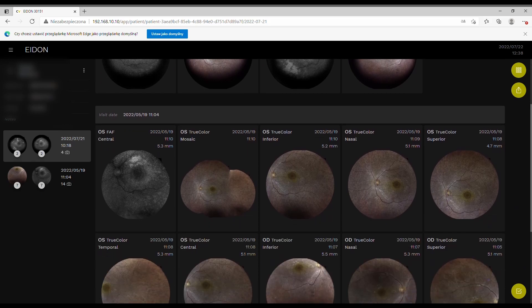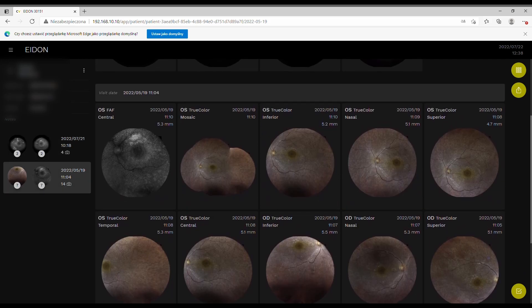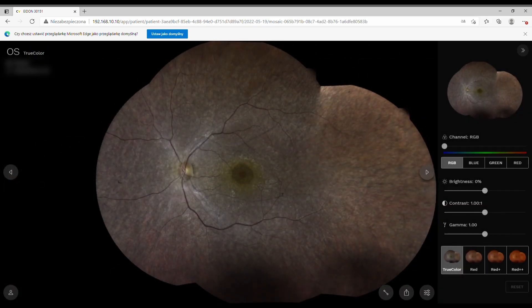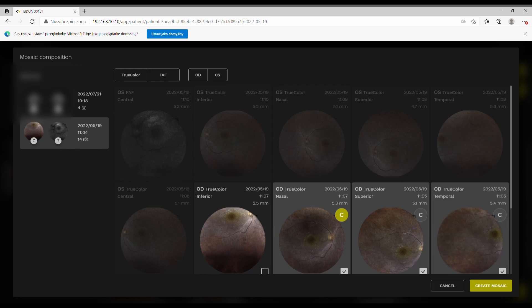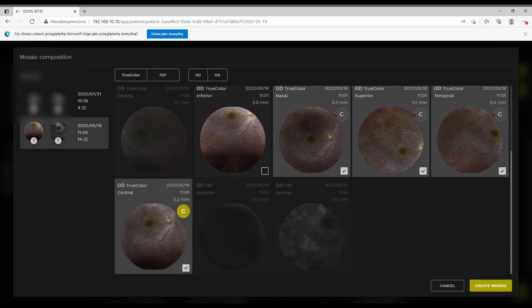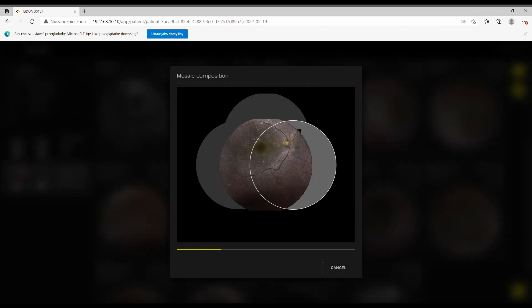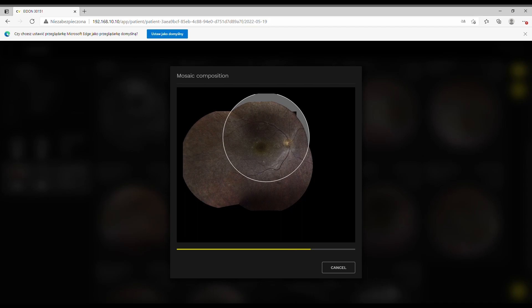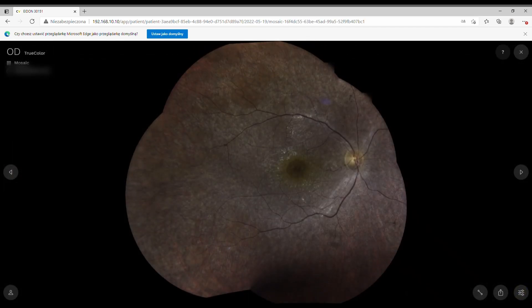If you click on a patient, all images taken are displayed. For mosaics, you can either select the image type before taking shots or create one afterward — once done it stays in the system. You can apply all the same filters to mosaics as to single shots, including Red Plus Plus. The mosaic looks very nice with no visible junctions or bubble effects.